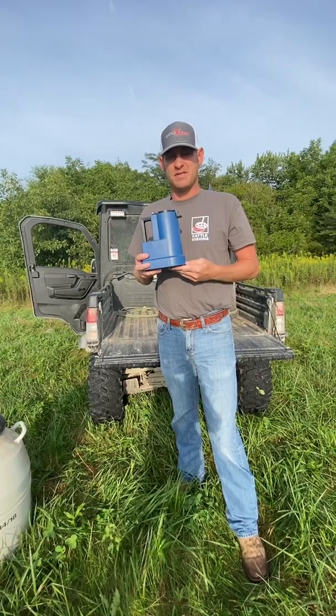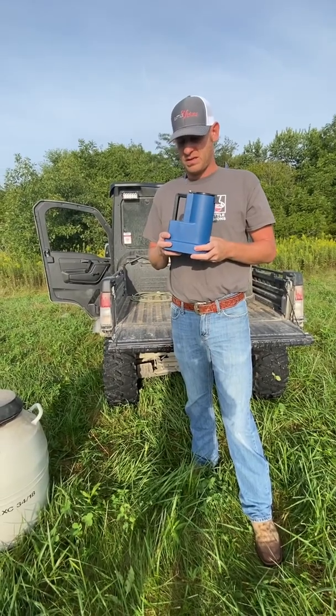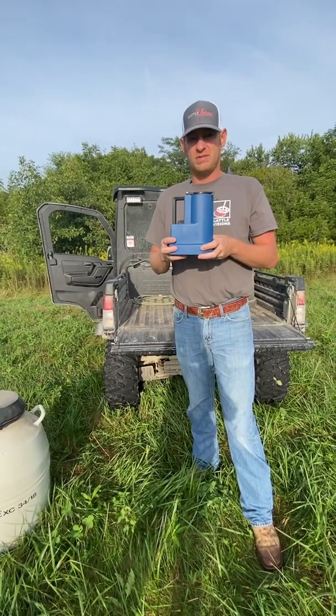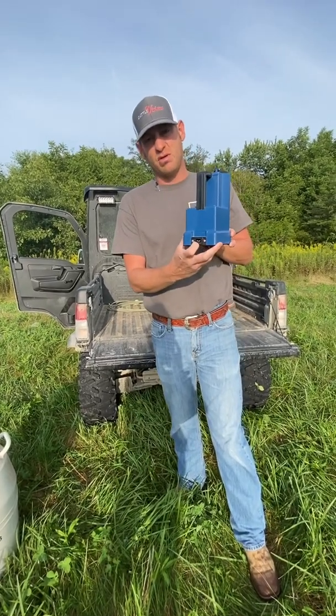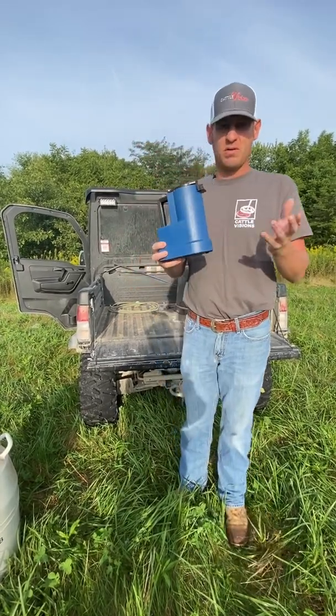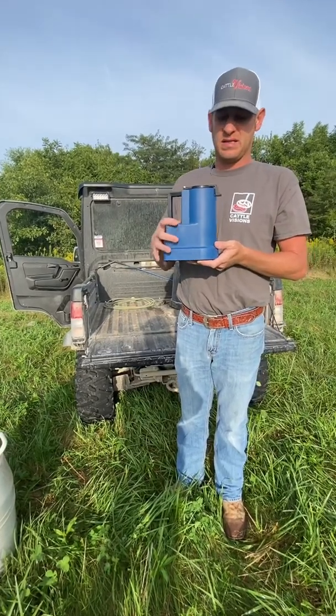Hi everybody, Ryan Anderson with Unlimited Genetics Incorporated. Today I just want to talk about our Cedo thaw unit that we sell. This does 110 and 12 volt compatible — it will come with both cords.